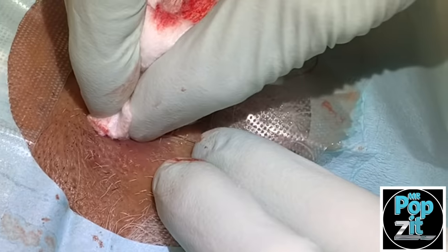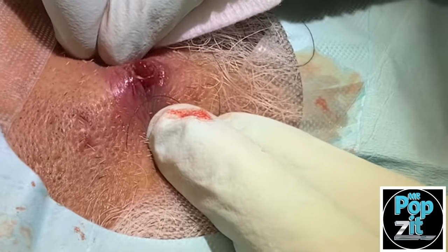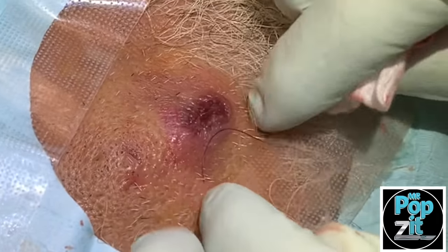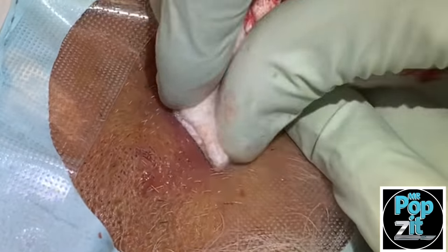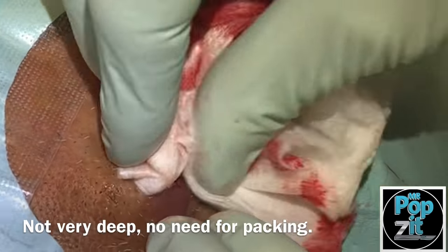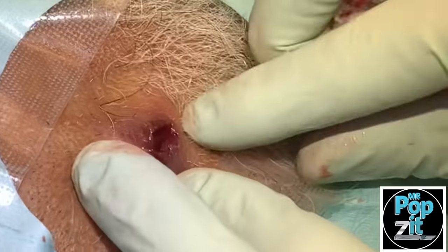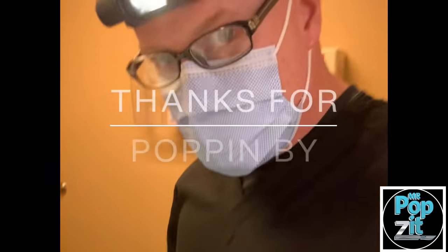That cyst was probably only about a centimeter but it really got inflamed. He's going to get a scab that will eventually peel off. We'll leave that open so it can drain, it's going to heal, and then we're going to see him back. There aren't any more pockets in there — it's not super deep, not a lot of loculations or deep pockets like you'd find on the buttocks or on the back. Simple I&D, we just want to get that pressure out. He's going to sleep a lot better tonight, and we'll get him on an antibiotic.